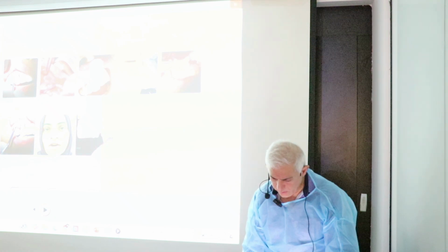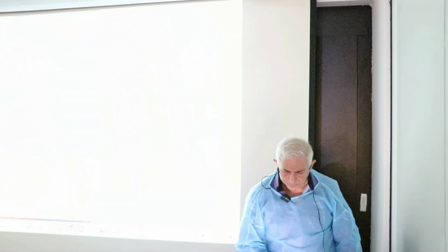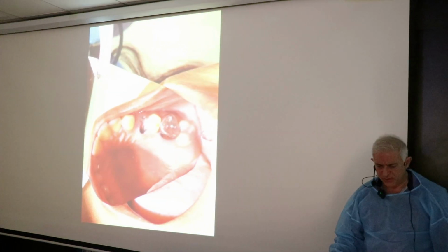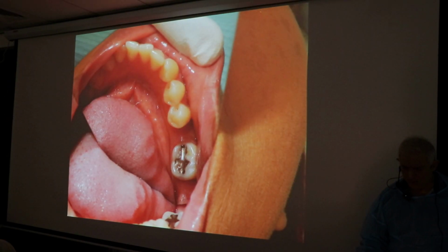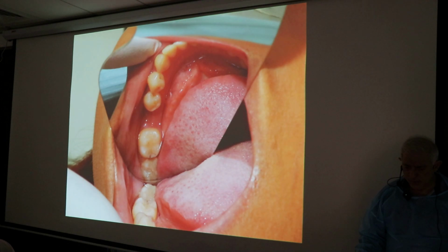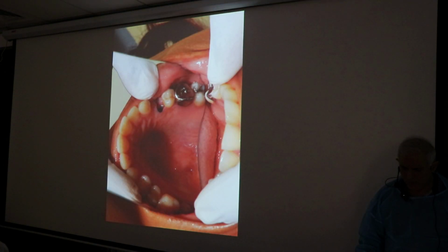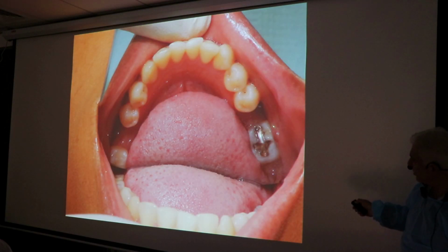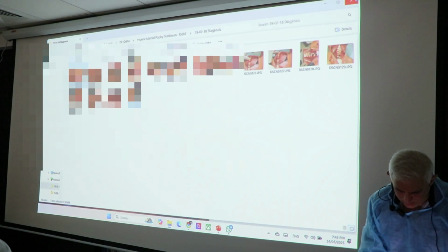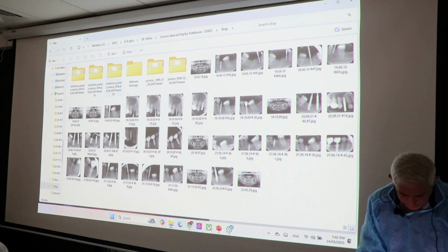Now, let's close this. Regarding the other topics, since we are in orthodontic treatment, the orthodontic diagnosis in this case is interesting. The patient comes with a narrow space on the left lower, and the other areas seem to have a sufficient amount of mesiodistal space for placing implants. So we did everything by the book, except we didn't pay attention at the time of diagnosis to this area. The patient is philosophical, which means she listens to whatever we say and does not ask any questions. Let me show you some x-rays.